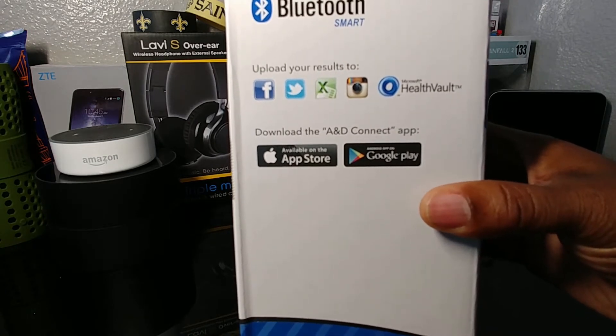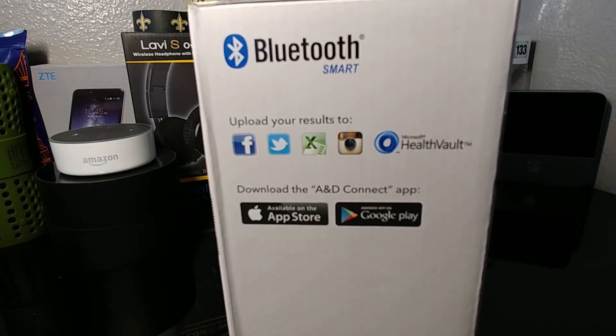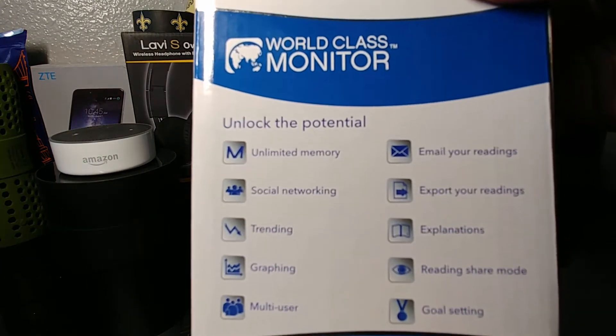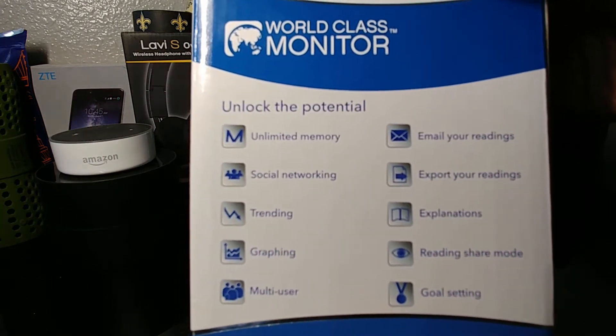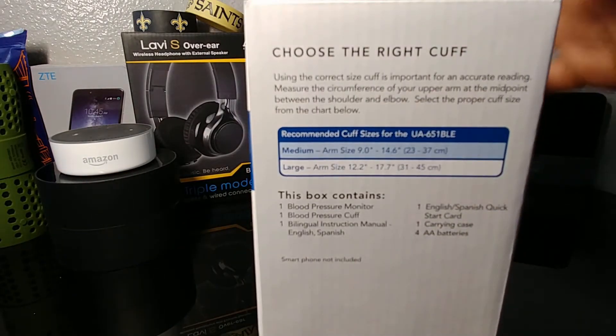Microsoft has a Health Vault that you can upload it to, which would be useful if you have to go to the doctor and the doctor is set up with Microsoft Health Vault — you could securely and easily upload your information. By the time you get there the blood pressure may have changed, but at least it'll give the doctor a head start on how to diagnose whatever you're visiting for. And you can see there are some other features listed, plus what's in the box.